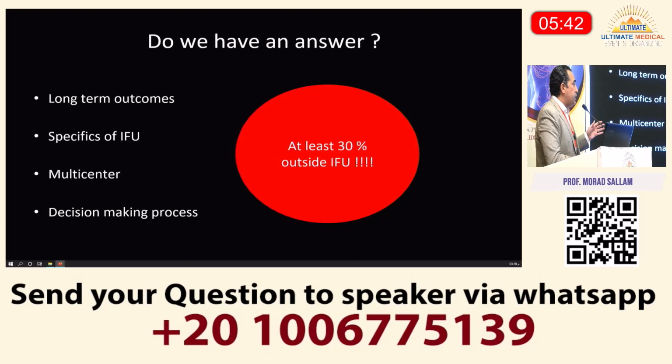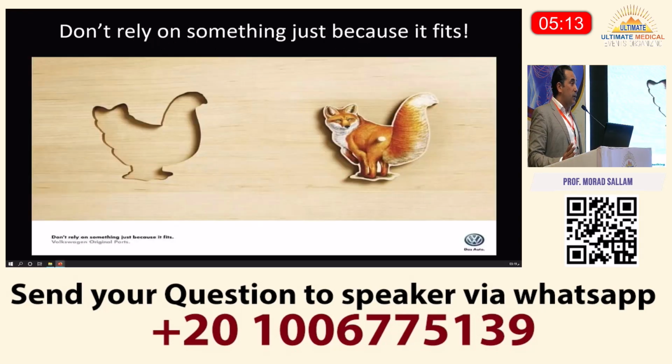Years down the line, last year at PAVSS, I presented a bit of a debate on whether we should stick to IFU or not. And I have to say, I couldn't find a very definitive answer, and tried to be on the balance. But what I found in the literature is that at least 30% of the current abdominal EVARs implanted and published in the literature are outside IFU. This is a shocking number, quite a big one. And the debate will carry on until we have better data. But generally speaking, I wouldn't recommend that we use devices outside IFU. They are made for a reason. It is safer to comply with the manufacturer's advice, and not because it fits, it will work well.